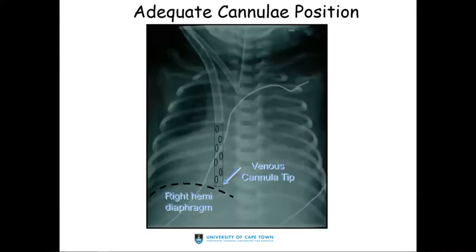And then just remember, in the children, because they haven't been walking and their femoral arteries aren't big enough for these cannulas, they actually end up ligating off a carotid artery and returning down a carotid artery. And then that can't be squirting directly on the aortic valve, because you do still need the heart to eject. Otherwise, you could end up with a clotted heart.